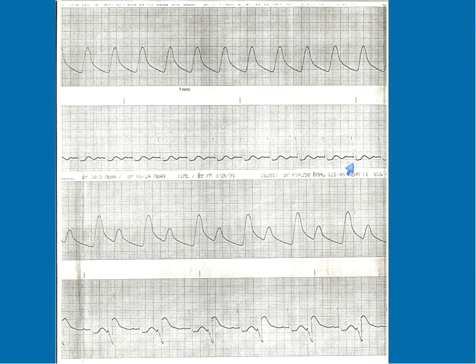This is a normal ECG, and here is the arterial line. Remember we said invasive monitoring. Sometimes these patients have a catheter that's inserted in an artery. The transducer is level so that we can decide what zero is, and you can see the beat-to-beat blood pressure here.